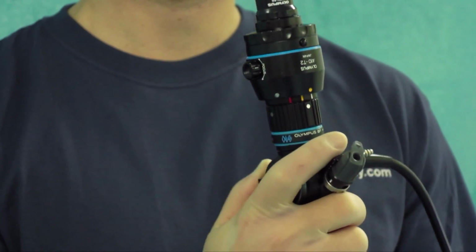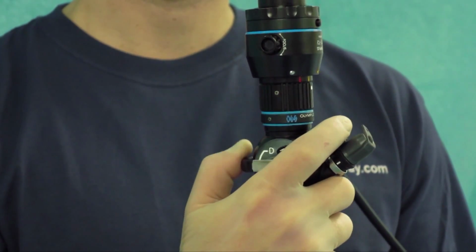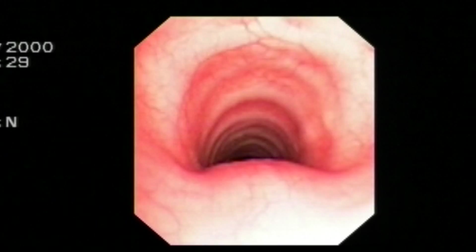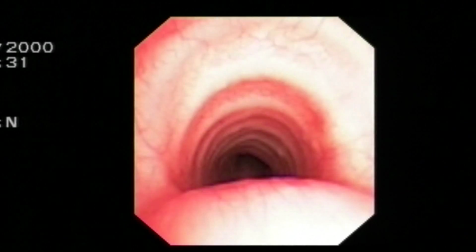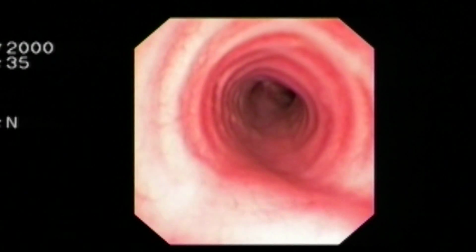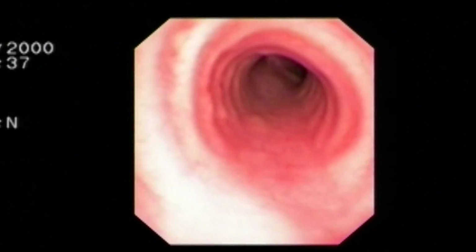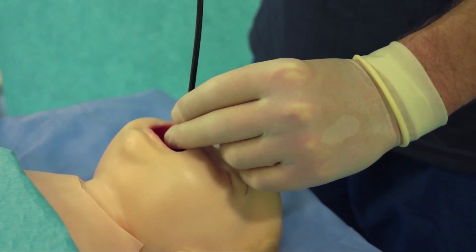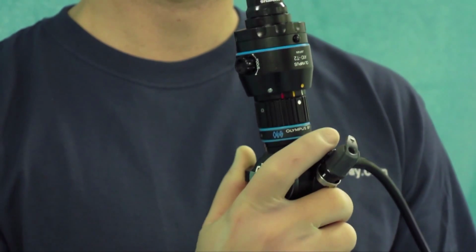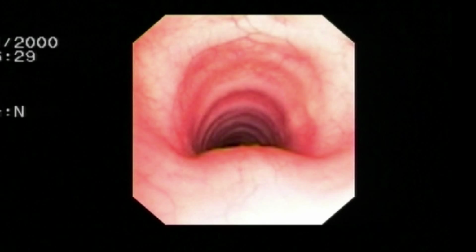The fine points. When entering the pediatric airway, turn the scope and move the shifter so that your target always appears in the middle of the image. Then push the scope forward carefully. If you lose sight, pull the scope back. Turn it and move the shifter until you get the image back.